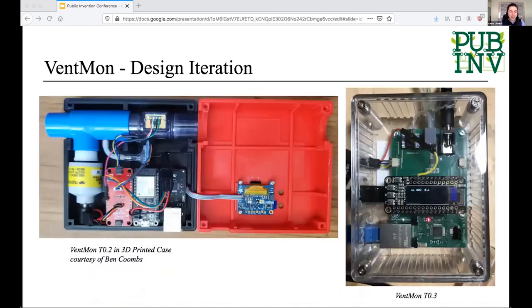Here are a couple more steps in that design process. The third version of Ventmon includes the custom printed circuit board, which allowed us to get all our sensors in one spot and really decreased the assembly time needed to build these devices.